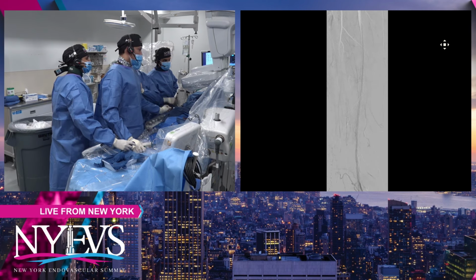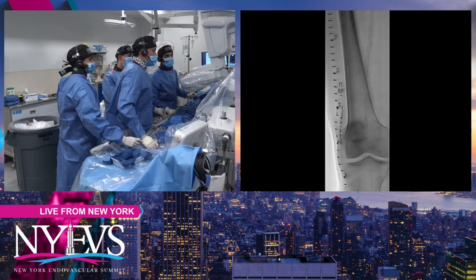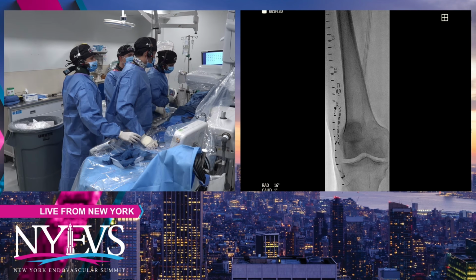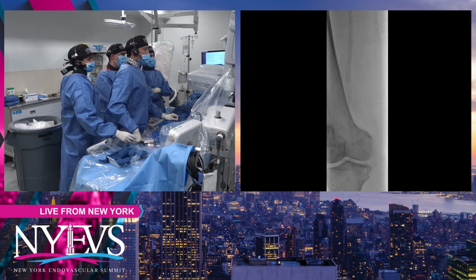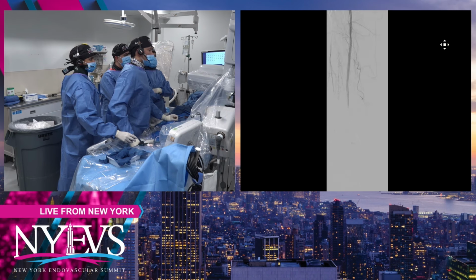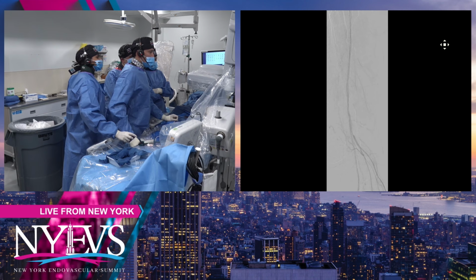Yeah, there's the one dissected area, but I think once you start chasing those things around, you could end up in a much worse position. So for the panel, I guess asking everyone, what would their next step be? I'm going to show you in the last shot of the popliteal another view of that so-called dissection or haziness. But Professor Zeller, what's the next step for you here?